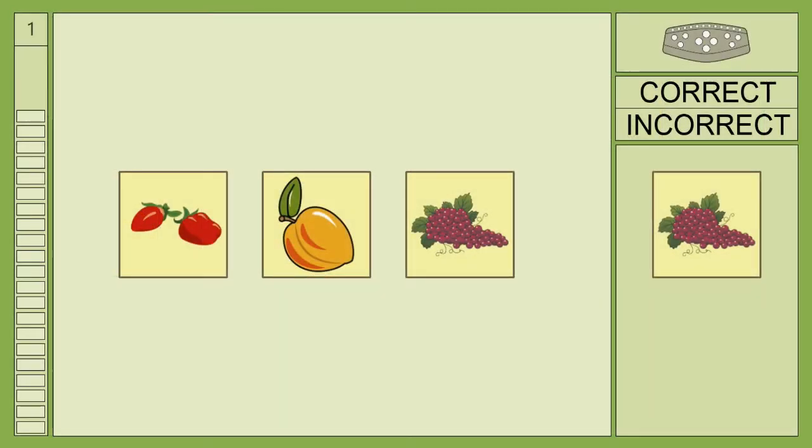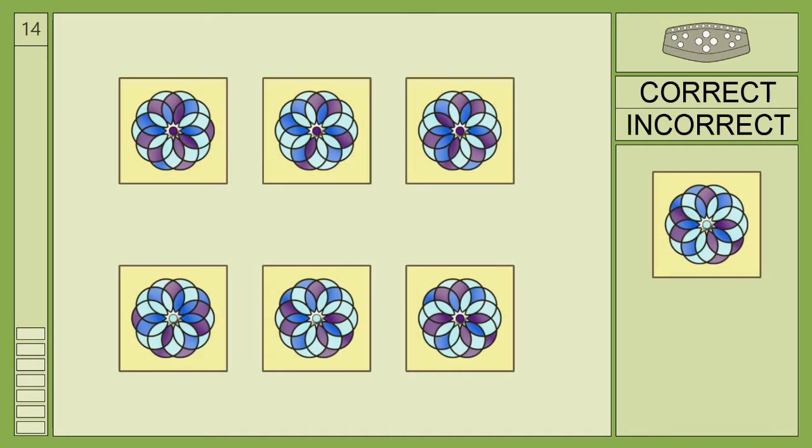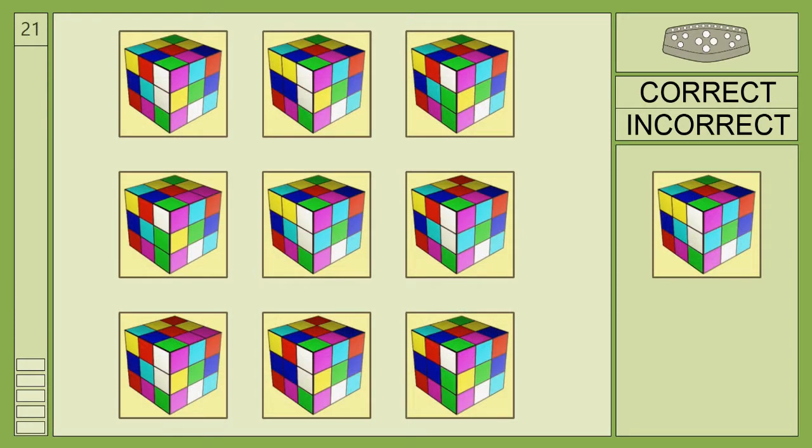With rising difficulty, there will be a greater number of objects with increasing complexity. Rehacom works auto-adaptively—the difficulty level will rise or fall depending on the patient's performance. The performance bar illustrates the development, and with each change in level, the user will receive additional feedback.